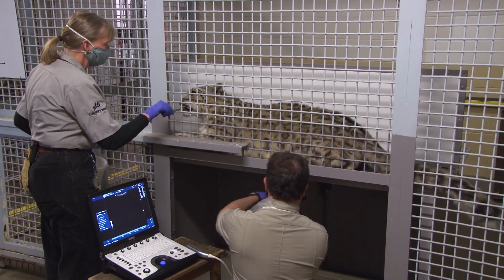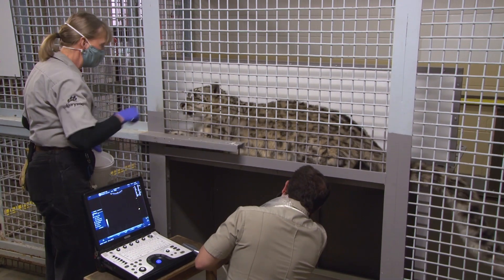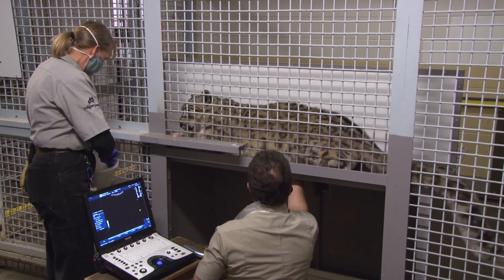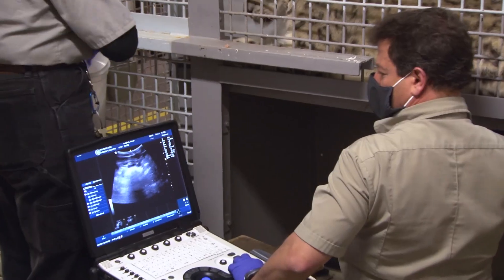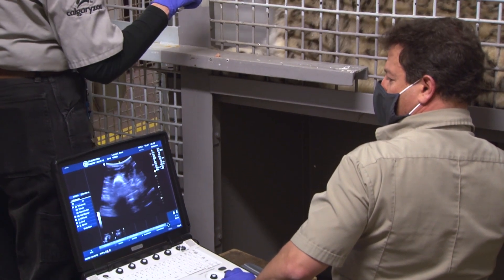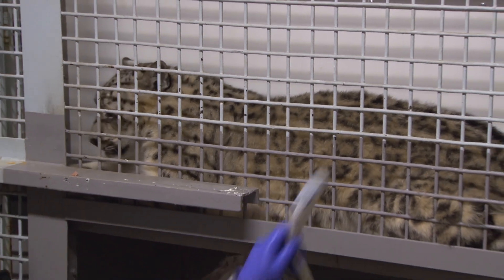We have a little dish of rubbing alcohol that he's warmed up, and he will put it up against her belly to get the fur nice and wet. Then he will use the ultrasound gel. And as he's doing the ultrasound, he'll take pictures as he goes along, and we just continue feeding her in place.